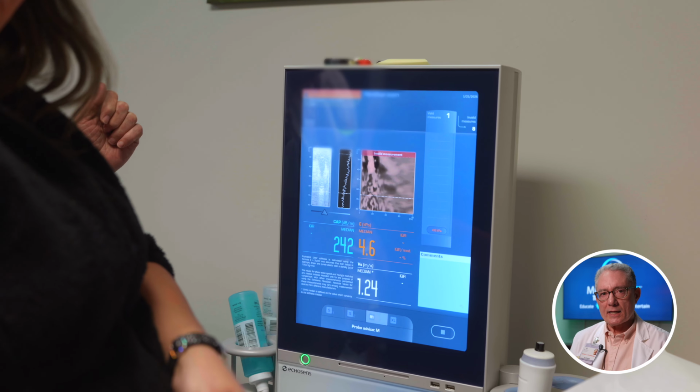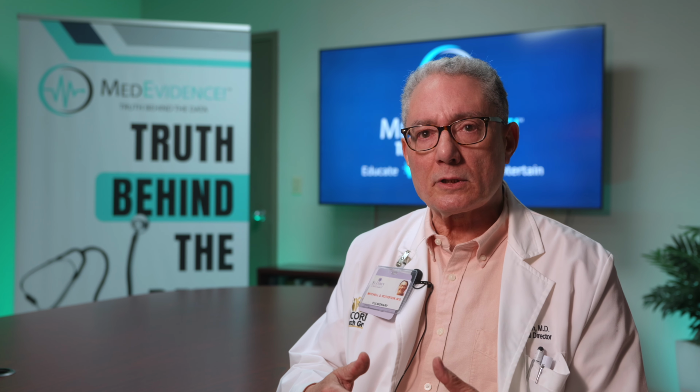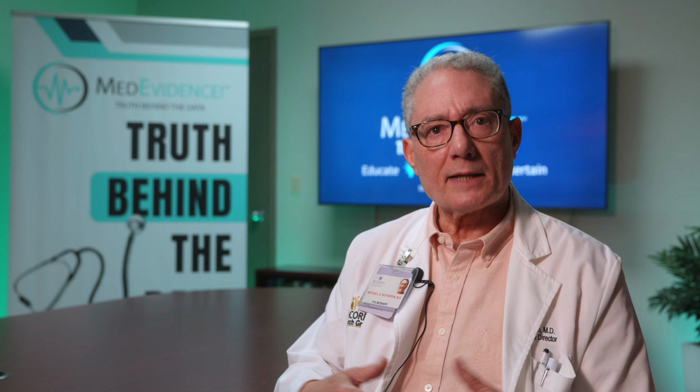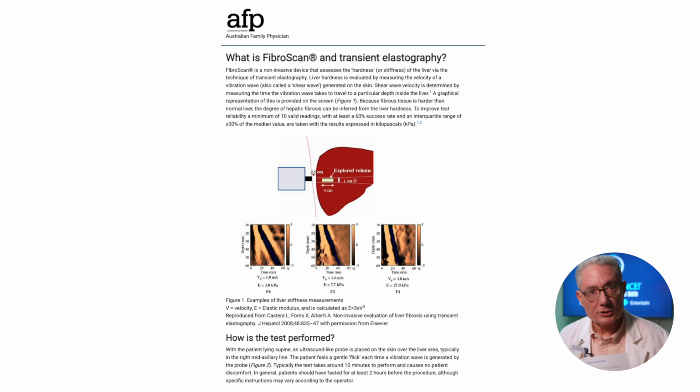in the liver as well as the fat content of the liver. And it does this by measuring shear wave technology. The way FibroScanning actually works is we have a device, a probe. In this case, the probe is represented on this graphic, and you're going to see a real probe in just a minute.